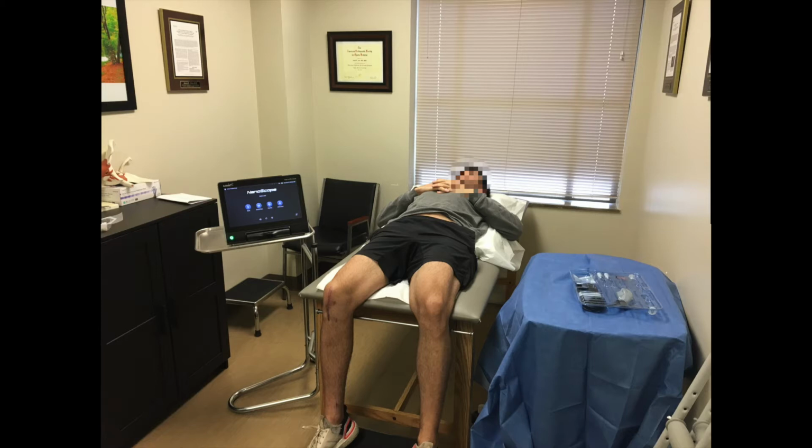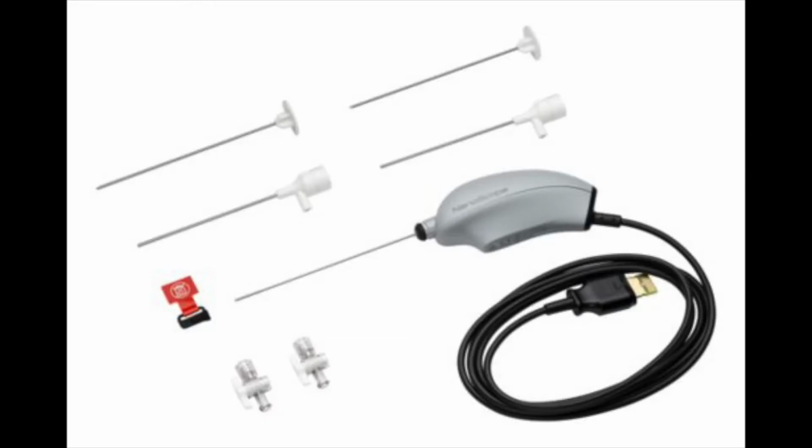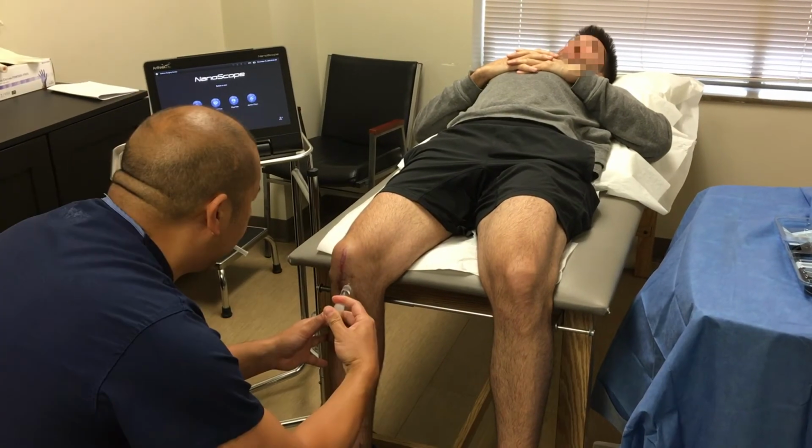In this case, at the 2-month mark, the patient opted for an in-office nanoarthroscopy to actually visualize the lesion. The NanoScope from Arthrex is a tiny chip-on-a-tip camera with a console. And here I am with the patient in the office.